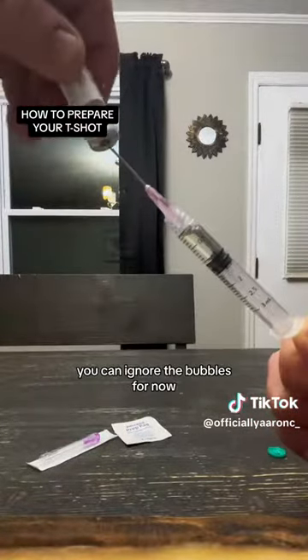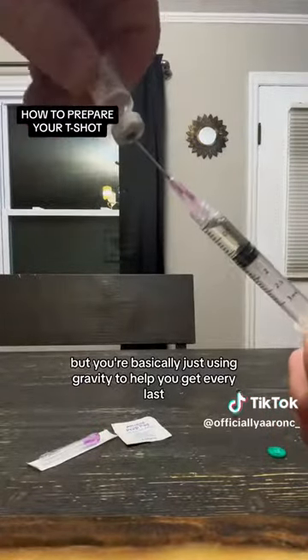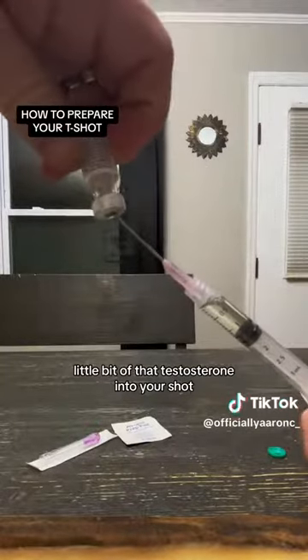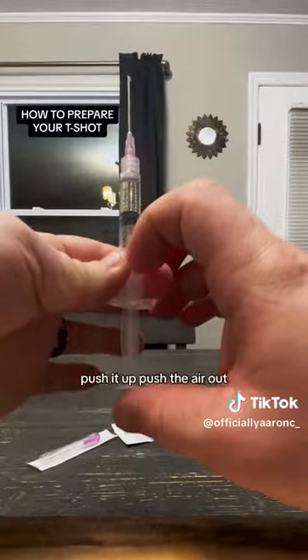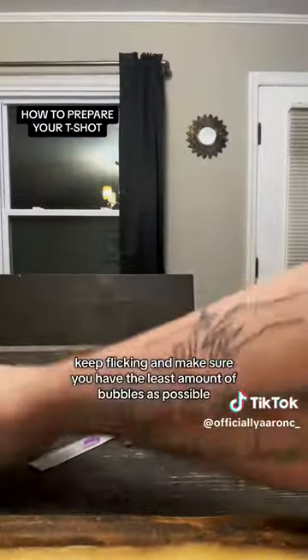You can ignore the bubbles for now — we'll fix those later. You're basically just using gravity to help you get every last little bit of that testosterone into your shot to make sure you're getting the proper dosage. Once you've got that out, flick and get the bubbles out, push the air out, keep flicking until you have the least amount of bubbles possible.